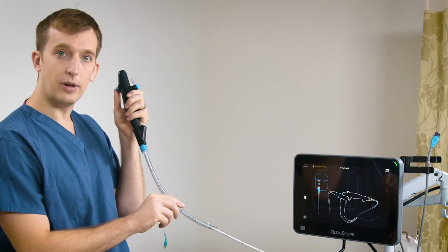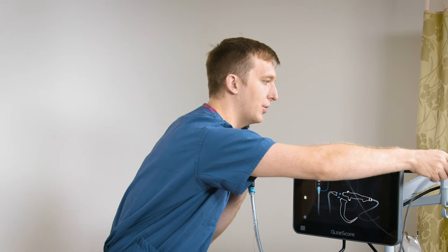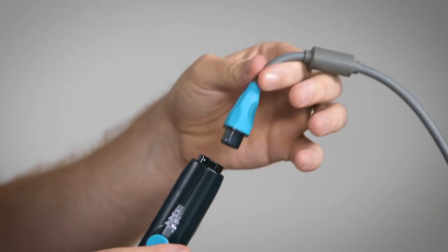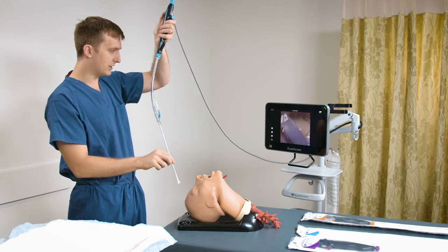With my endotracheal tube loaded, I'm now ready to connect my bronchoscope using the quick connect cable with a magnetic connector. Once connected, I have an image on the monitor and I'm ready to begin my procedure.